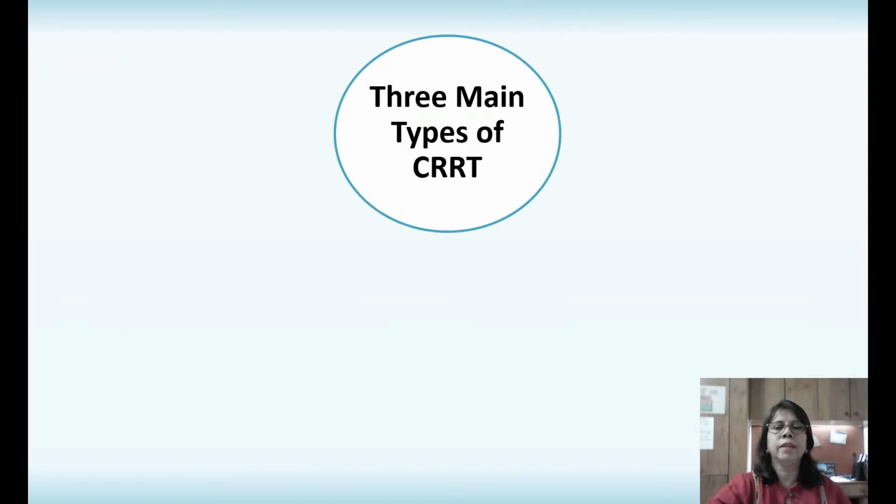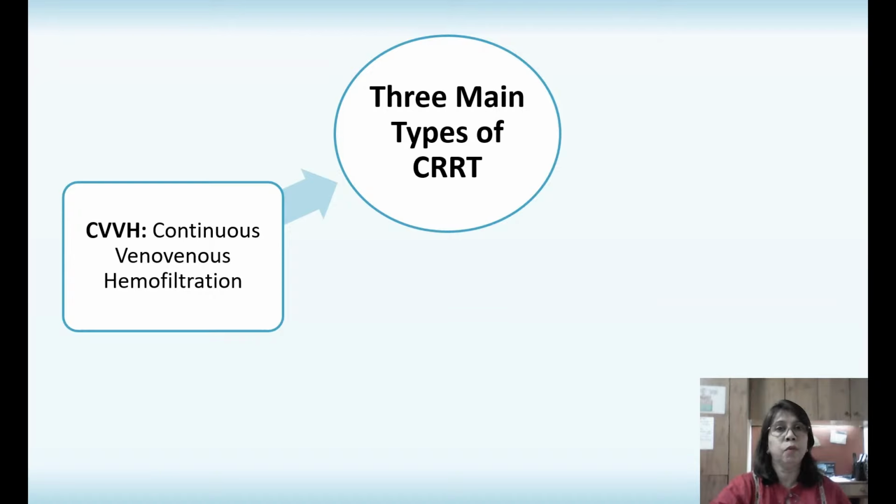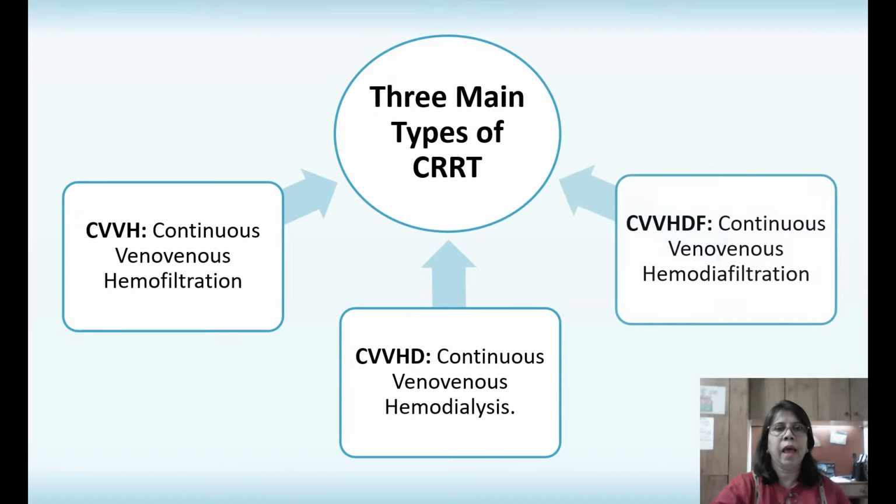Once again, let's remember the three types of CRRT and dive into these. The first is CVVH, that is the continuous veno-venous hemofiltration. The second is the continuous veno-venous hemodialysis. And the third is the continuous veno-venous hemodiafiltration.